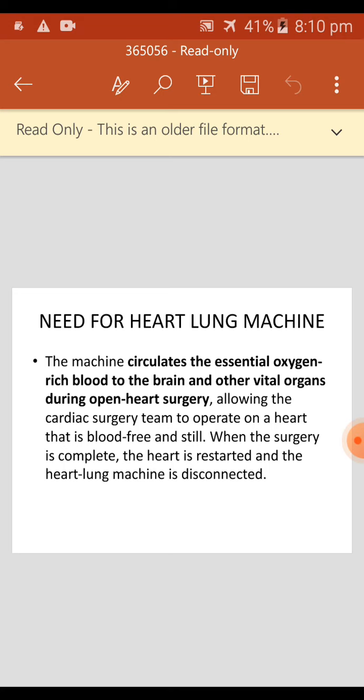Dosed delivery of liquids with the precise display of the actual flow rate and delivered volume. External control mechanism, this is monitoring functions. Third, sufficient pressure or vacuum generation. Next, minimal blood damage. Then adjustable occlusion settings. This is nothing but for roller pumps only. Next, pulsatile flow generation, high efficiency, high reliability and safety, option for emergency operation, for example manual operation.